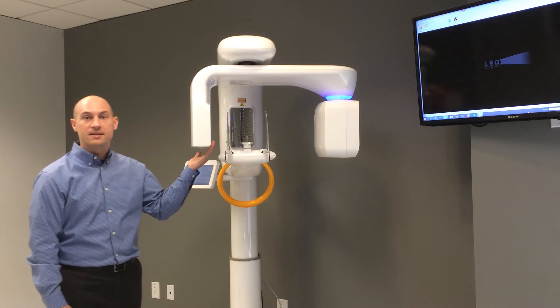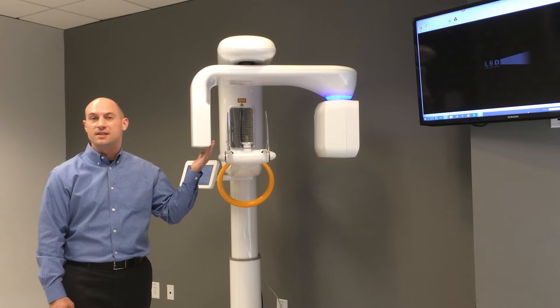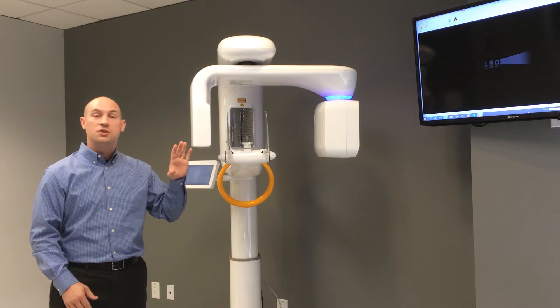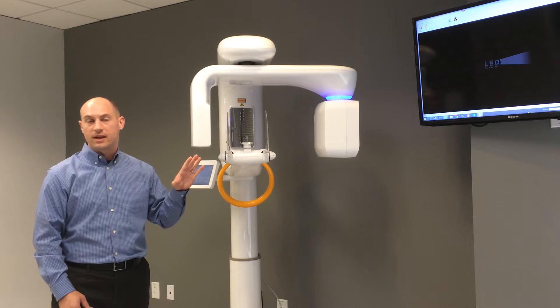Opposite the generator is the sensor or detector side, where we have a dedicated sensor for pan and a dedicated sensor for CT. As we switch between modalities, you may hear a gear moving left or right inside, where the machine is moving the pan or CT sensor in front of the generator for that specific acquisition.